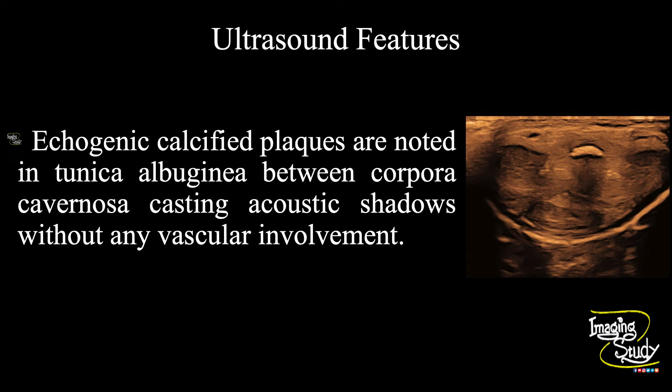In summary, echogenic calcified plaques are noted within the tunica albuginea between the two corpora cavernosa, casting acoustic shadows without any vascular involvement. These features conclude it as a case of Peyronie disease.